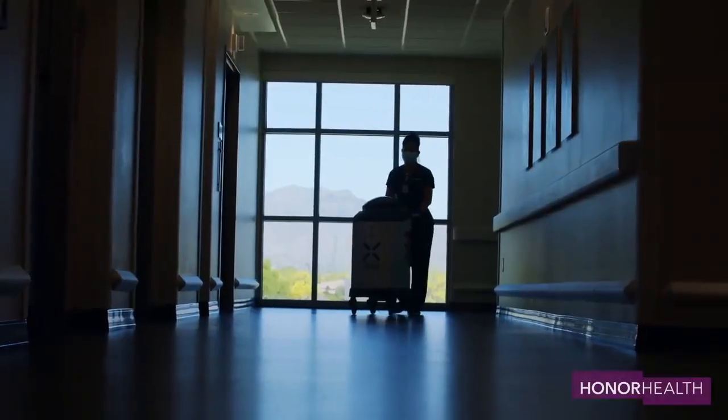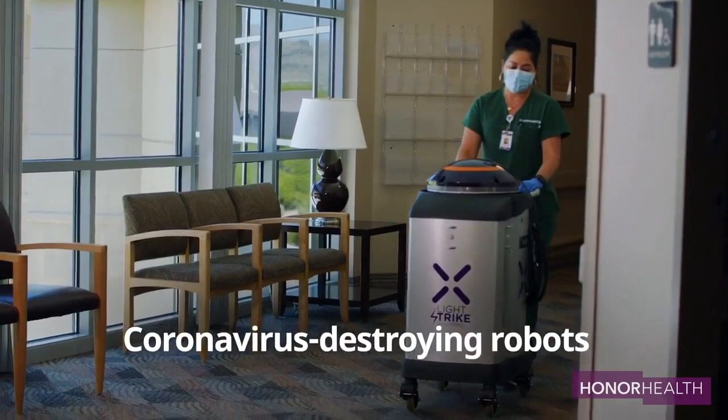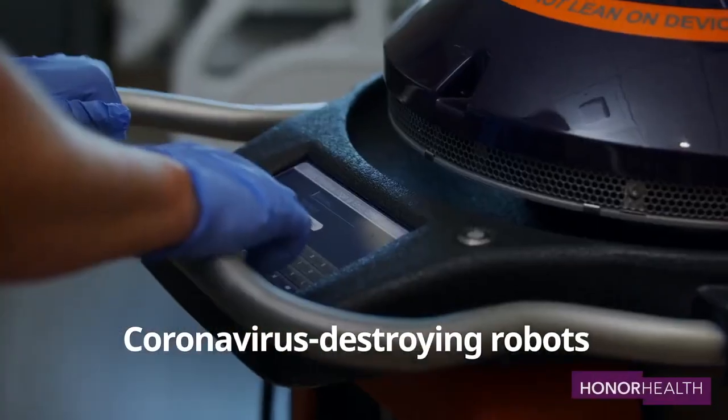HonorHealth hospitals are taking measures to protect your health when you visit their facilities, including having a germ-zapping robot that can destroy the coronavirus. Here's how it works: the robot uses UV light to disinfect every surface in a room, destroying germs and viruses that may survive manual cleanings.